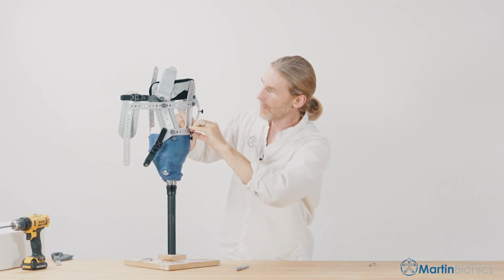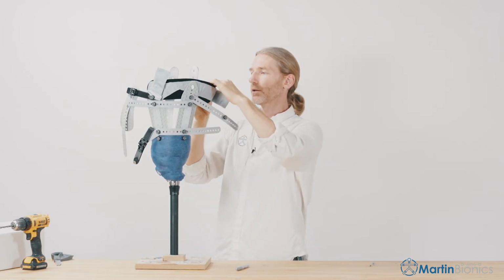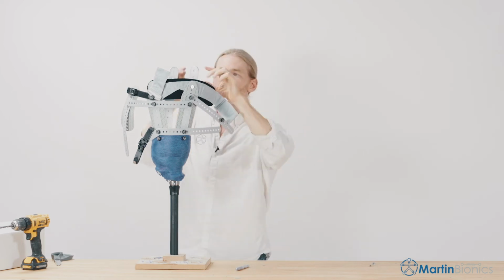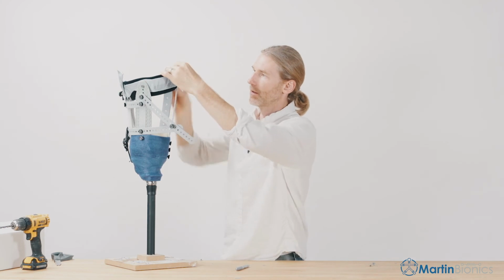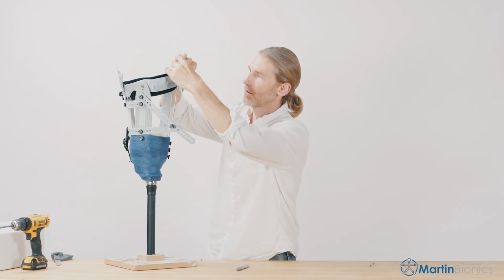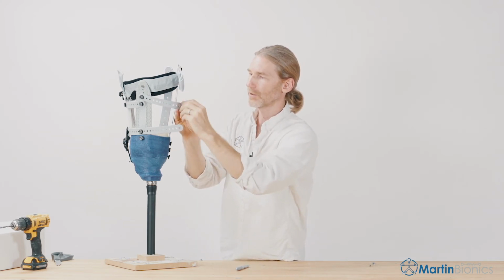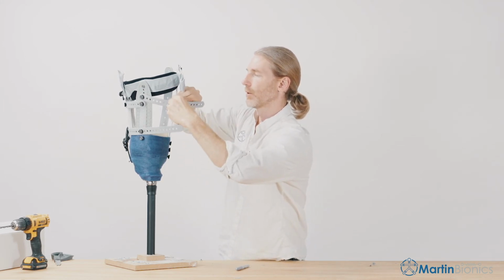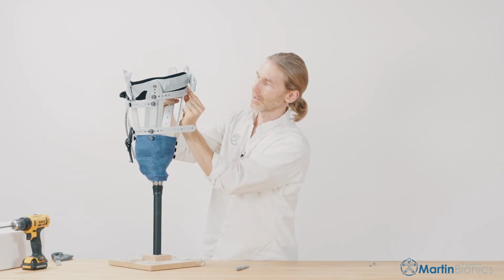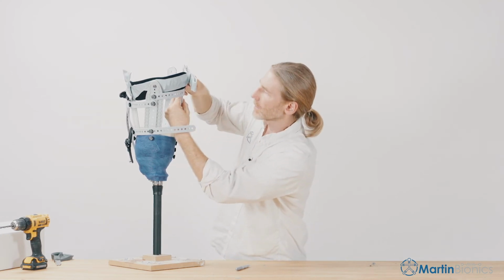All right, so we're assembled here. Medial panel looks good. I'm going to connect the posterior. So on the proximal end of the posterior medial strut, put my truss nut through, bring my webbing up, thumb screw back in. On the proximal posterior cross connector, this should go in the 4th hole down on the posterior lateral strut, 1, 2, 3, 4. And then it should just pull snug. And we'll adjust the length of the webbing. That looks pretty good right about there.